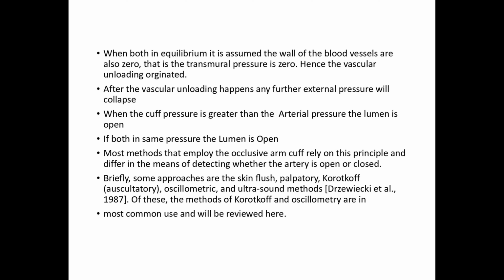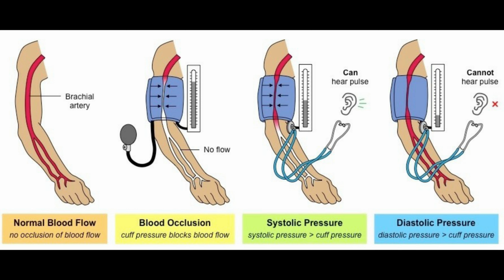Out of all these, we will be looking into two methods. Majorly, the Korotkoff sound method, and another one, the oscillometric method. Now mostly all medical equipment and patient monitors follow this oscillometric method for non-invasive blood pressure monitoring. Not only non-invasive, in invasive also, this is the method they follow.